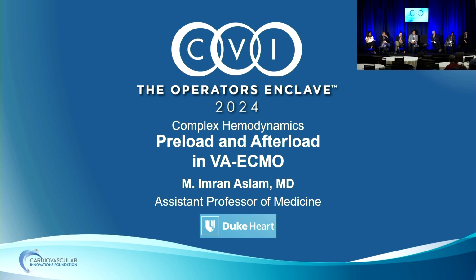And then choosing, instead of your standard 17 French, if that's what you go for ECMO, de-escalating, say, just put a 15 French in, go up front with DPCs, all this stuff to help avoid those ischemic limb complications. So I think the answer is yes. Our algorithm for these patients is definitely changing. It's just about the operator's comfort in managing the vascular complications and prophylactically managing the ischemic limb complications.